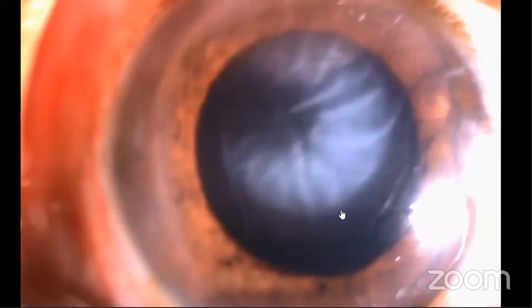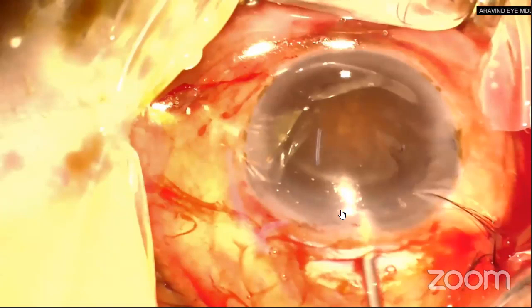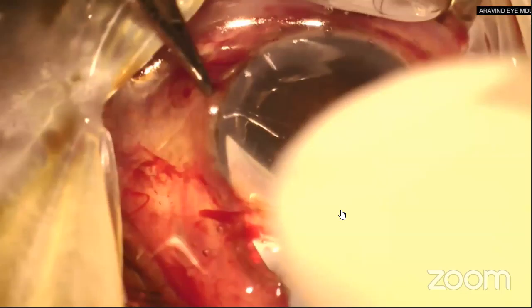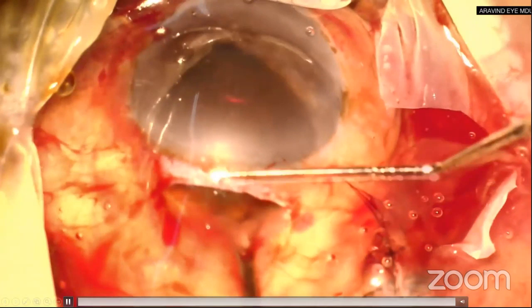But the next day, we might end up with a corneal edema and a striate keratopathy. Rather, check the width of the tunnel with a visco cannula, and if you suspect that the tunnel is not wide enough, extend it with a double-down keratome before delivery. And the next day, eventually you will have a clear cornea.